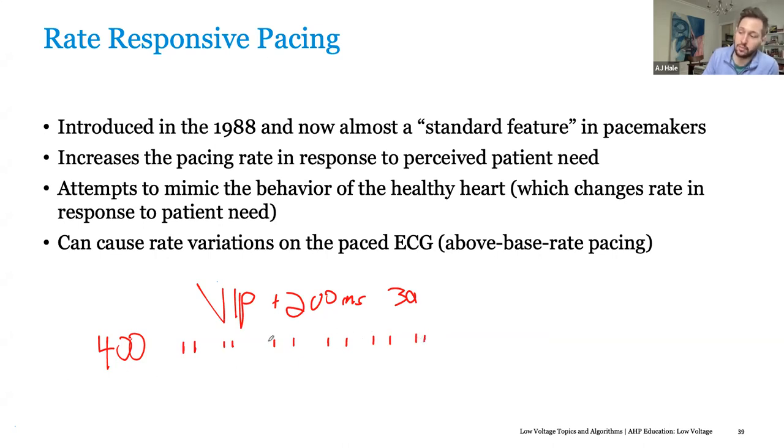So that means that most of the time you have this AV synchrony, and you get that extra 20 to 30% of your cardiac output. And if they are conducting, say an intrinsic event did occur right here, it would then leave the AV delay at 400 milliseconds. So at times when they are conducting, we're allowing them to break through, so we reduce our RV pacing. We're still following the atrium and shortening AV delays the rest of the time. So you're getting the best of both worlds. We're reducing RV pacing percentage, but also increasing the amount of atrial kick by allowing intrinsic conduction and not waiting too long. Does that make sense?